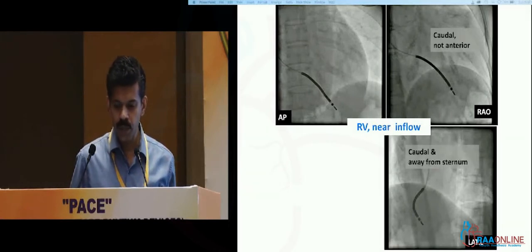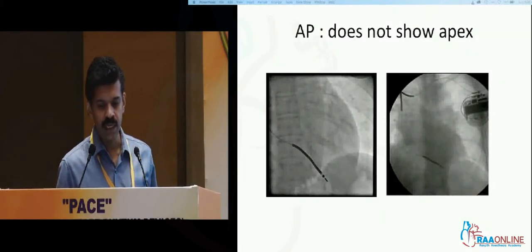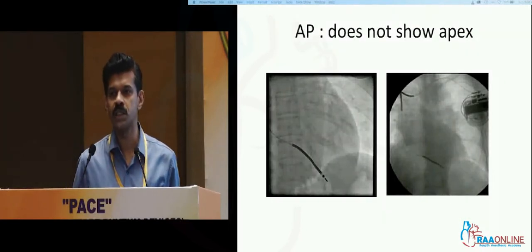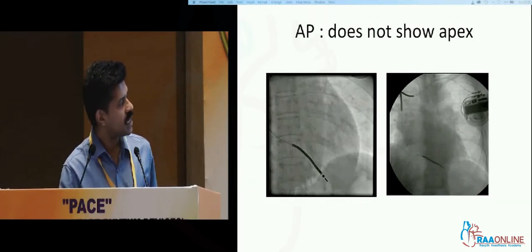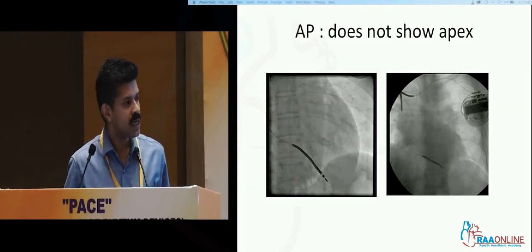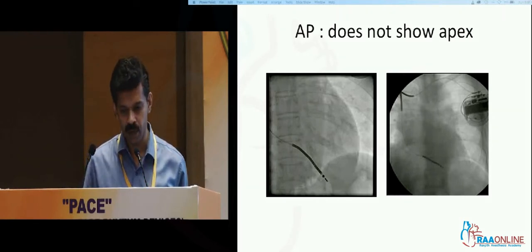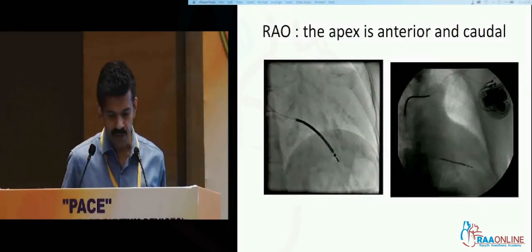The next point is that the anterior-posterior view hardly shows the apex. This is the first lead, and this is the second lead. This lead is near the apex; this lead is nowhere near the apex. So just using an AP view to find the apex will not be adequate — that's the first point.